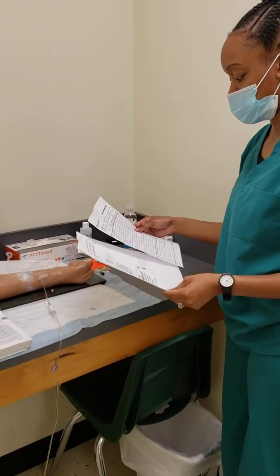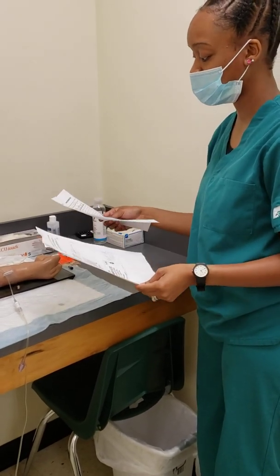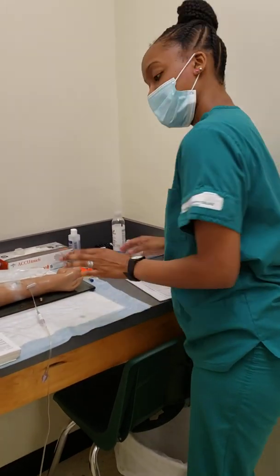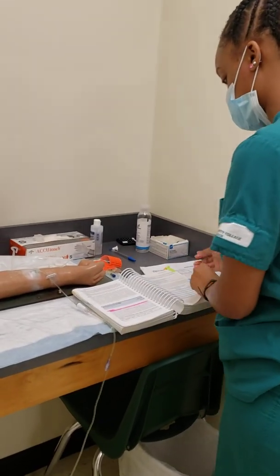She's going to be given 13 drops per minute. If it was on a pump, it'll be 50 milliliters per hour. And this medication is due at 8 a.m. And my physician's order and my MAR do match.